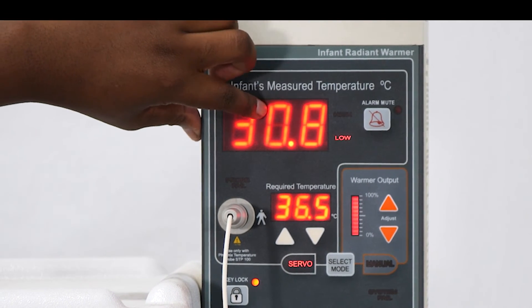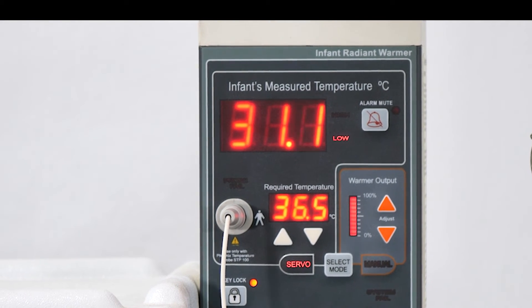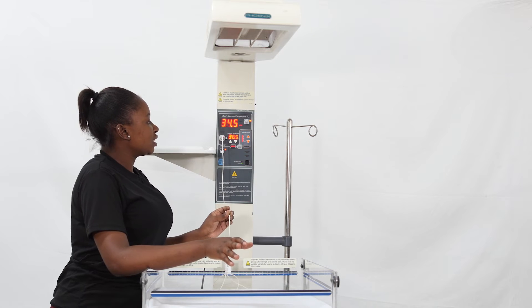The alarm is going off because the current probe temperature is well below the target. You can mute the alarm in the top right-hand corner. From there, we are going to select manual mode.